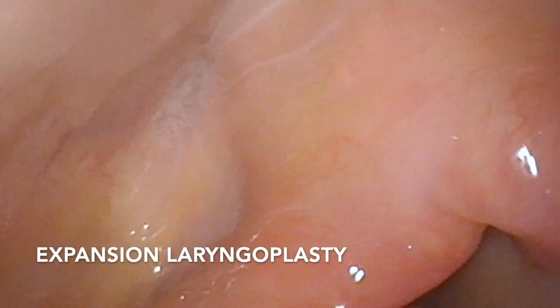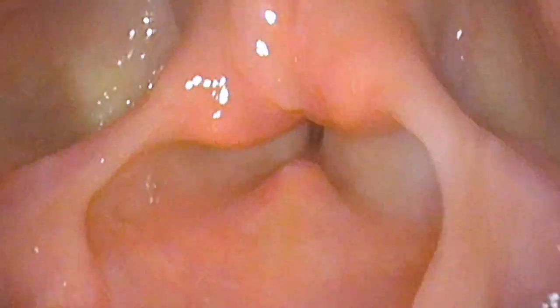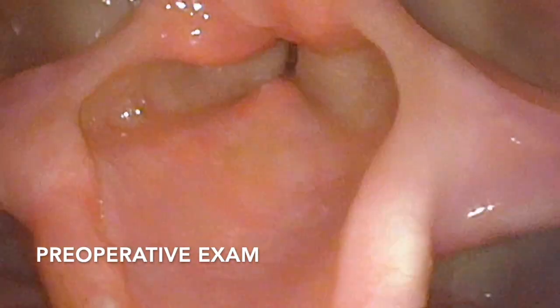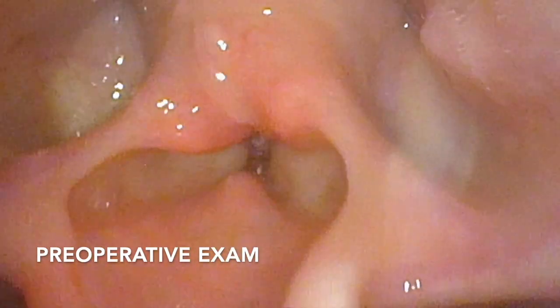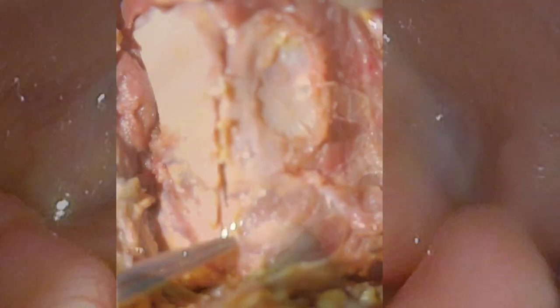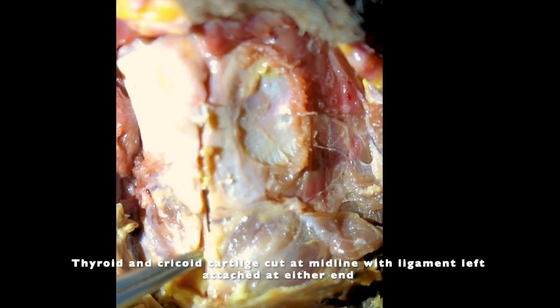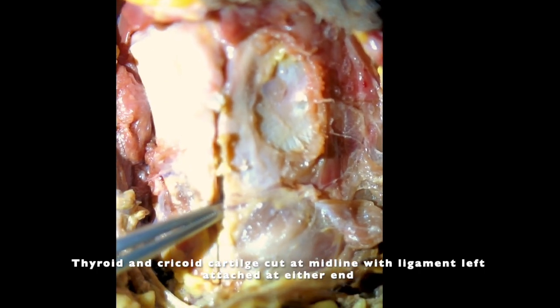We will now show the open expansion laryngoplasty in a dissection on a cadaver. This is a preoperative view of the patient with posterior stenosis. The costal cartilage graft has already been performed, and the laryngoplasty starts with an anterior-posterior cricoid split along with laryngo-fissure.